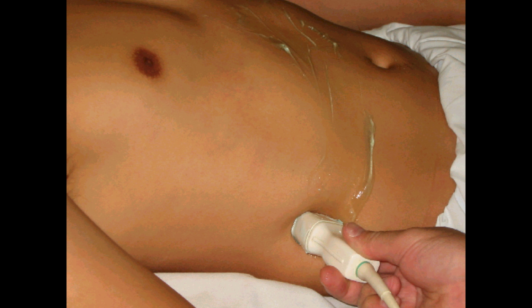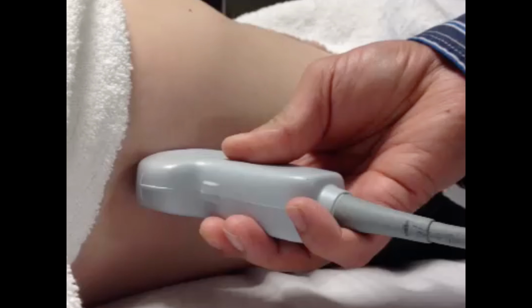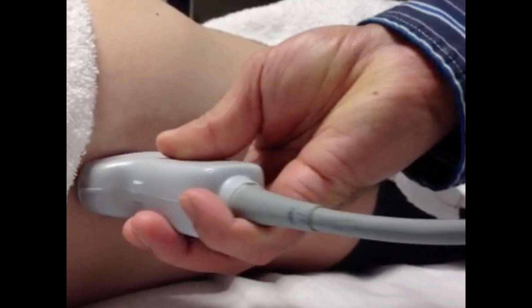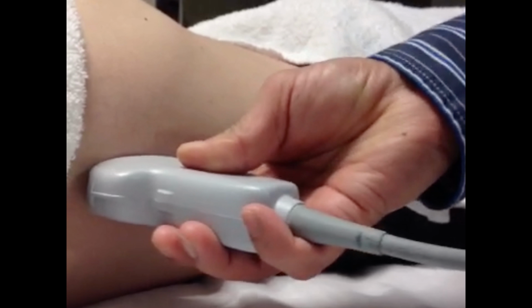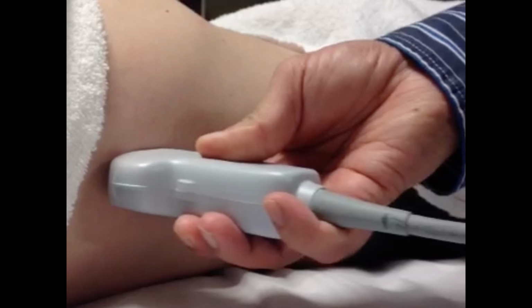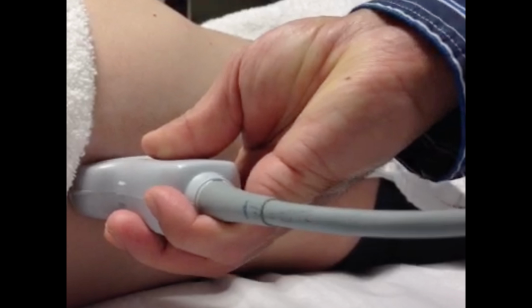Again, this is the side of the body you're going to be using. This probe marker is facing towards the head, always to the head or to the right of the patient with the EFAST. So this probe marker is to the head. And this is a nice, comfortable movement. You notice how the hand isn't flexed. It's not taut. Nice, comfortable movement back and forth. This is just rocking back and forth, looking in the right upper quadrant.